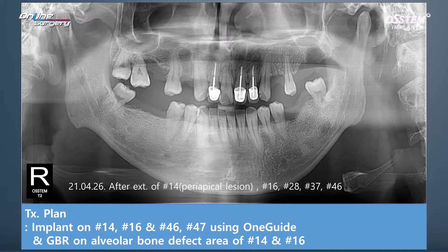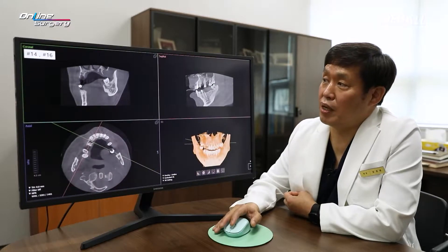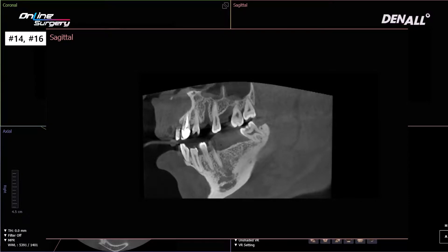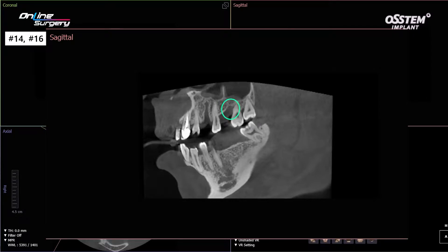In the upper and lower of the right side — No. 14, 16, 46, and 47 — one guide is going to be used to place the implant. In No. 14 and 16, where alveolar bone defect exists, GBR will be done. For No. 16, there is no bone on the distal side. Because of fistula in No. 14 on the apex side, if an implant is placed there, there will be a fenestration defect below the implant. On No. 16's distal side, significant alveolar bone destruction requires bone augmentation.